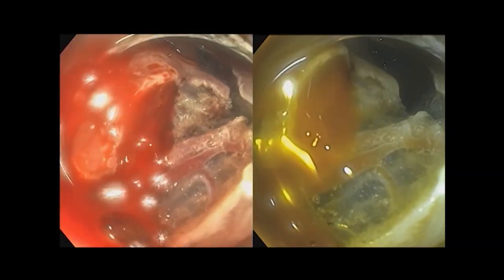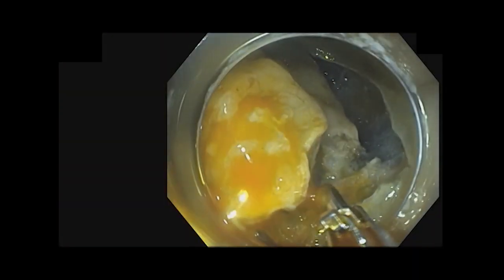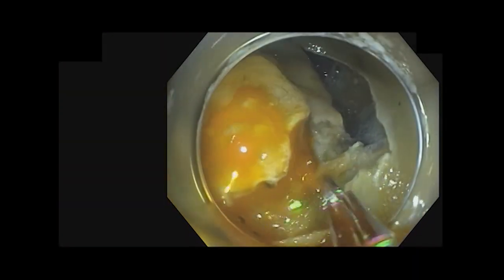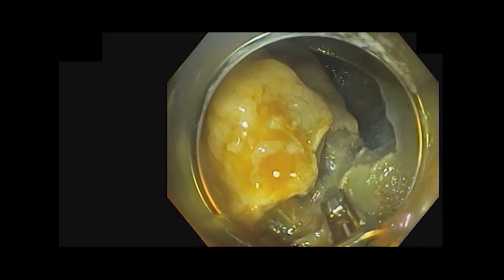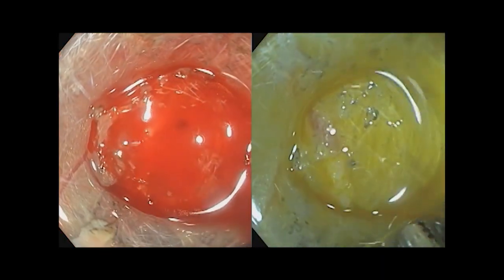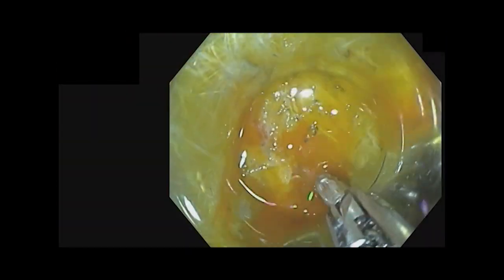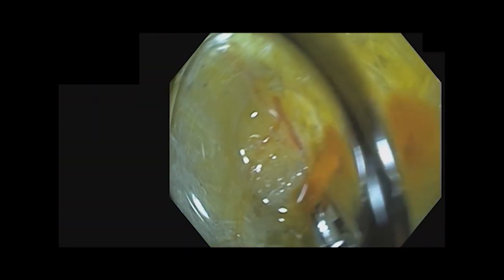In this video of brisk bleeding during ESD of a cecal polyp, we can appreciate how the dichromatic imaging mode enhances the identification of the bleeding point and allows for more targeted and precise hemostasis. By using lights of longer wavelength, red dichromatic imaging can penetrate biological tissues under the thin blood layer. This in turn creates a see-through effect and reduces the background noise of surrounding blood, and therefore enhances the detection of target vessels for hemostasis.